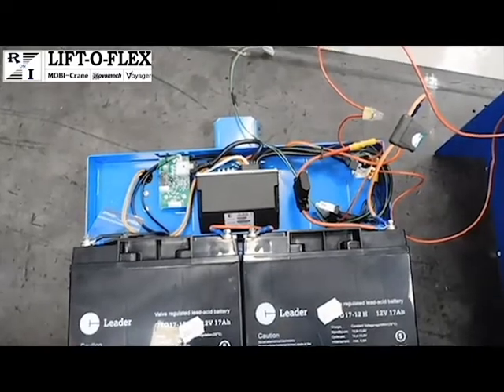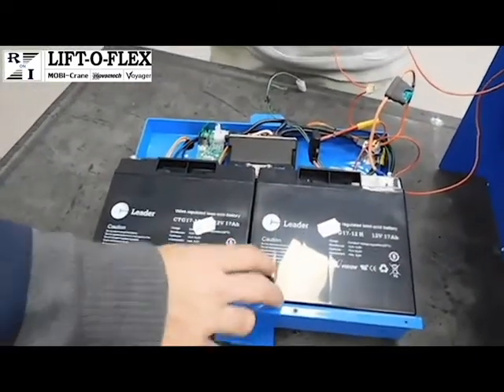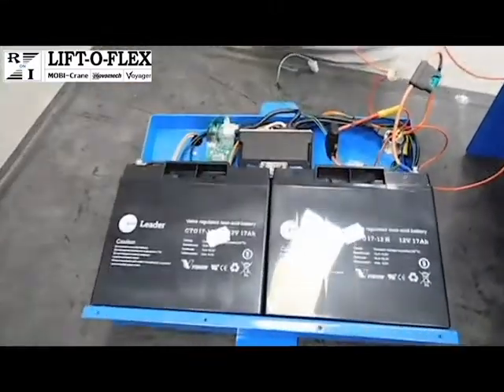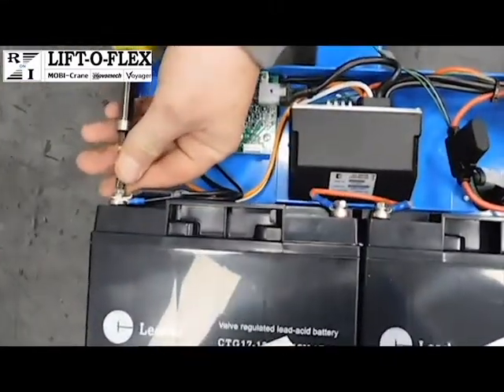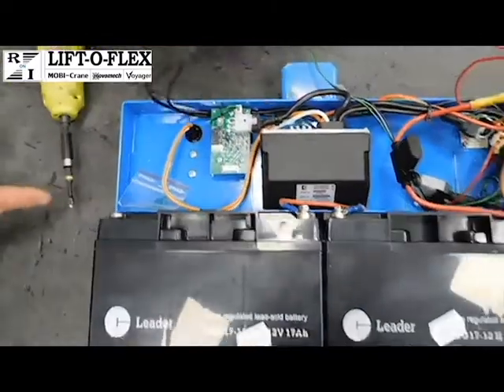Removal and replacement of the battery set. The batteries are the same. They're two 12-volt batteries. And we will show the disconnection here. The battery terminal has a hex head screw on it that's also a Phillips head.